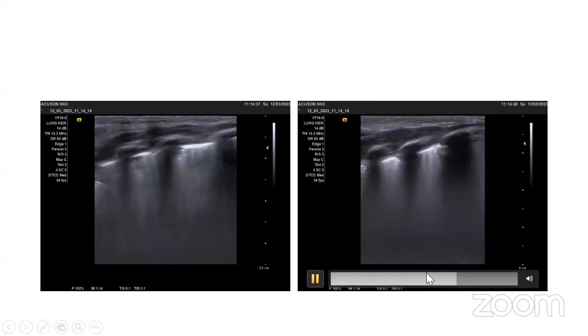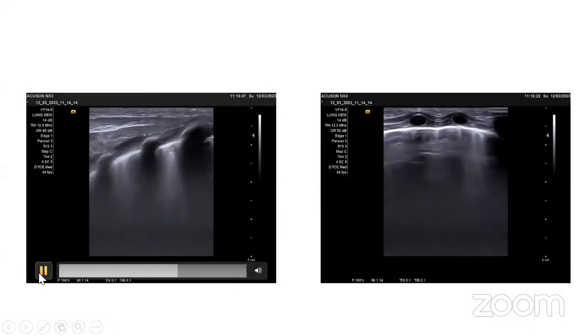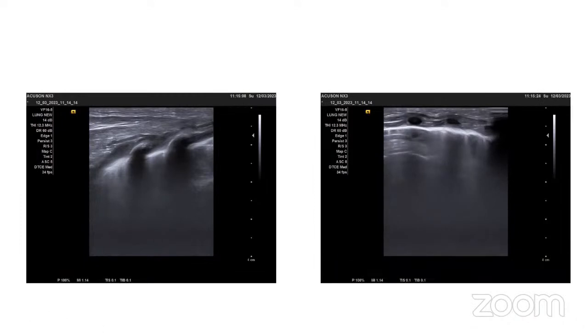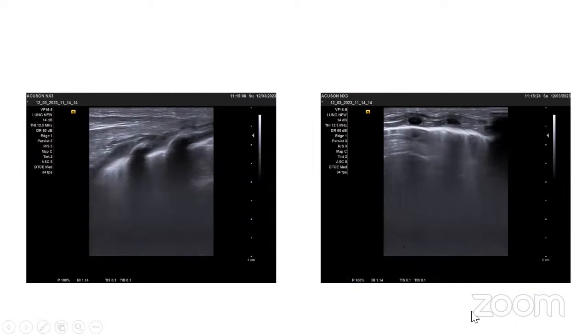Okay. So next one, this is the lateral view of the right lung, R3, R4. Here's the R3. Also the pleura is sliding here, and B profile mainly. I could see some A lines in the middle, and also some subpleural consolidation. For the R4, here the pleura is sliding, also some B lines, and I could see an AB profile, but no atelectasis or subpleural consolidation.